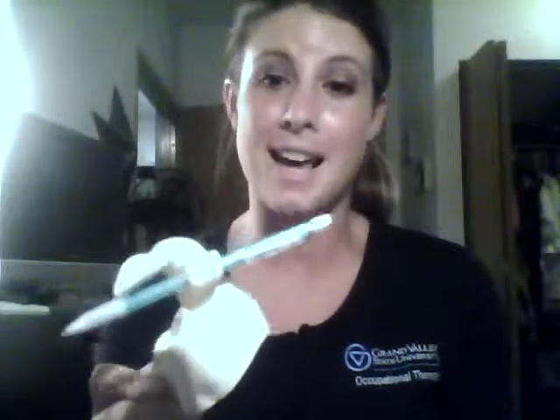It can be used for that. It can also be used to aid in social participation by allowing someone to get onto social media through a touchscreen device using this stylus. So this is really functional across a lot of areas of occupation, and it's small and easy to carry around. It's comfortable and very functional, and I can see someone using this every day.